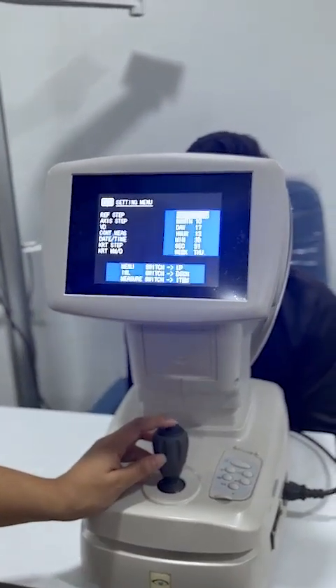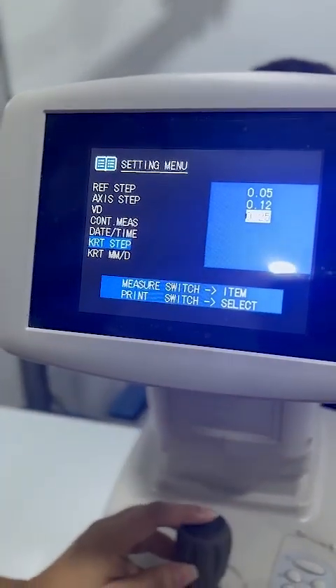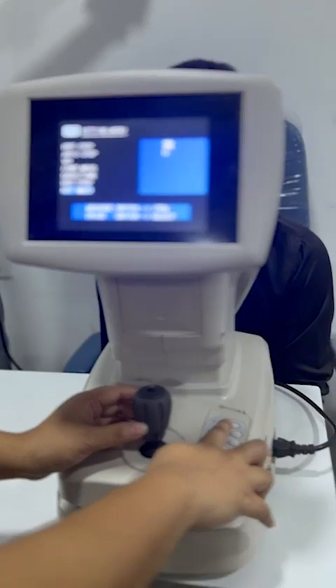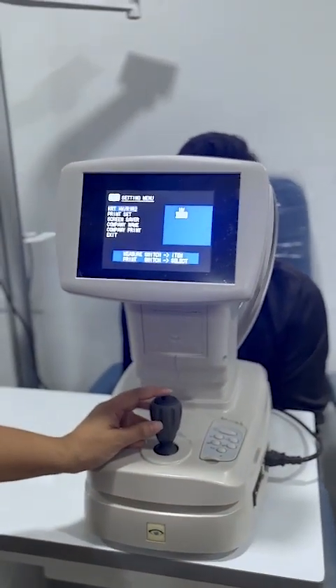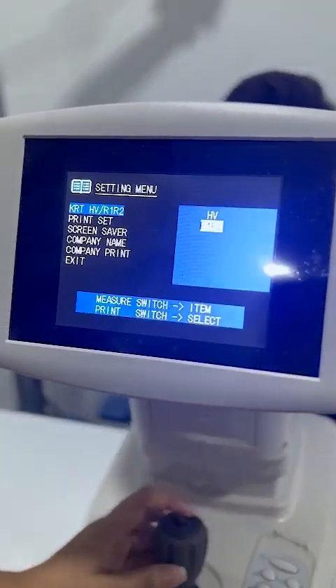These are the settings — as you can see, date and time. The keratometer step should also be 0.25. This is in mm, and with the printer button I can switch it to diopter value, which we require. Horizontal and vertical you can set, or R1 R2.